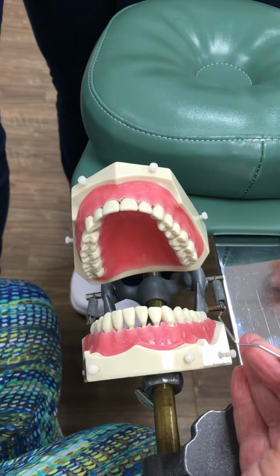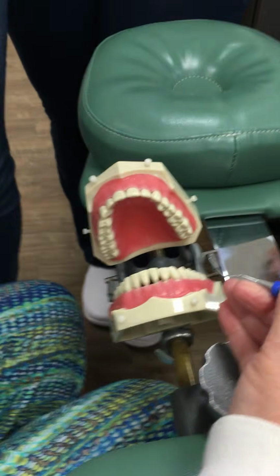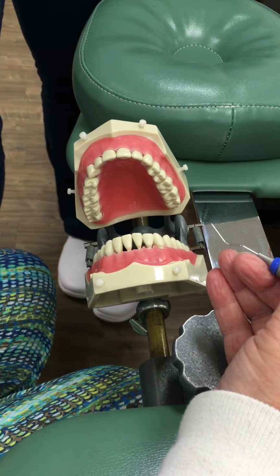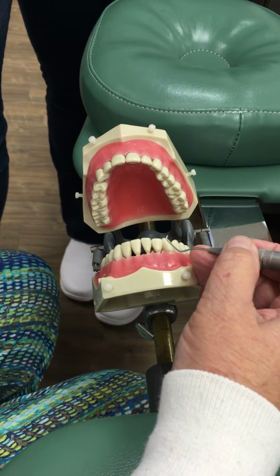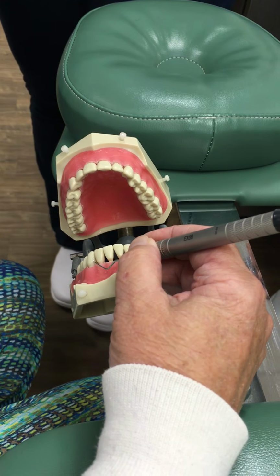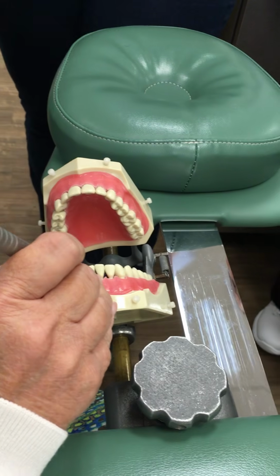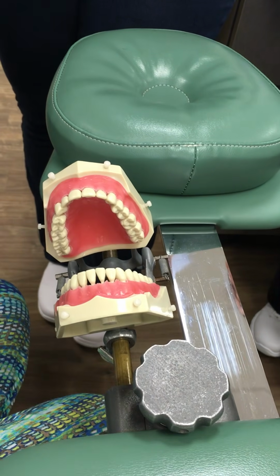And can anybody tell me why we do toward and away and not starting at the distal line angle like we did in the posterior? The midline? Because of the midline. So this would be distal, distal, distal, and then mesial, mesial, mesial. Do you see that? The distals are over here. So they're opposite one another.